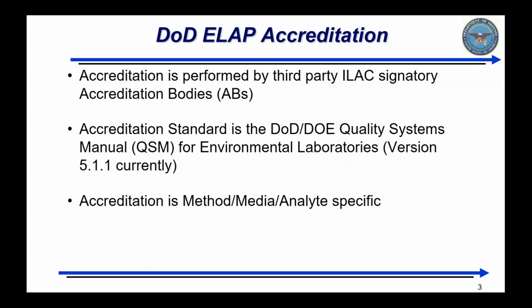With regard to analytical requirements for the DoD, any laboratory used to collect definitive PFAS data for environmental restoration projects, AFFF evaluation, and various other programs are required to be DoD ELAP accredited. The DoD's Environmental Laboratory Accreditation Program, ELAP, is an accreditation program which uses third-party ILAC signatory accreditation bodies to assess laboratories. The accreditation standard they assess to is based on the ISO 17025 2005 and the NELAC Institute TNI 2009 standard.